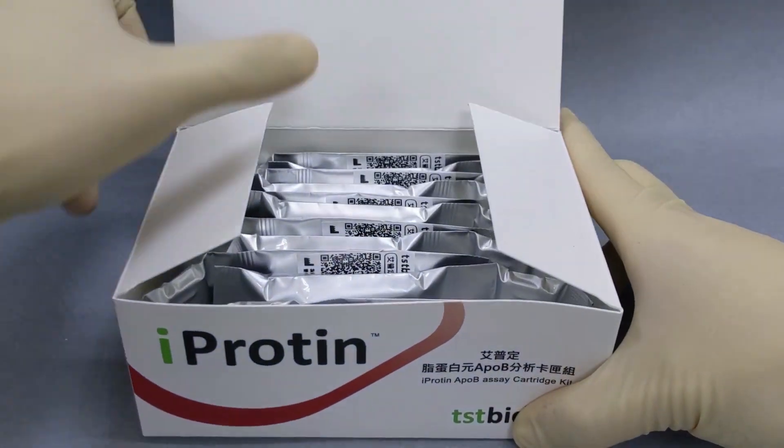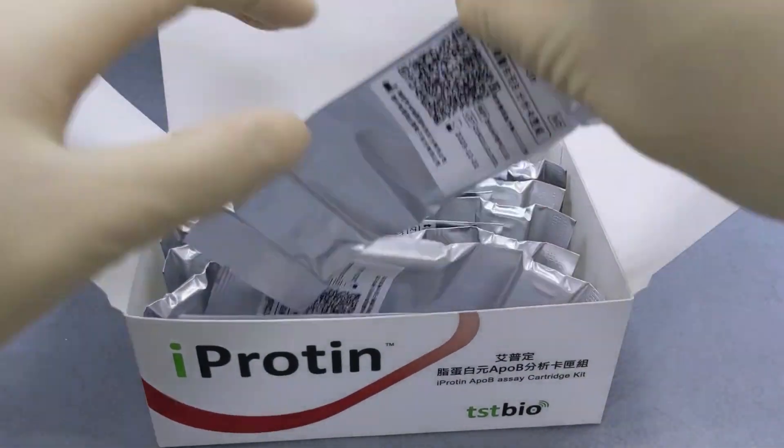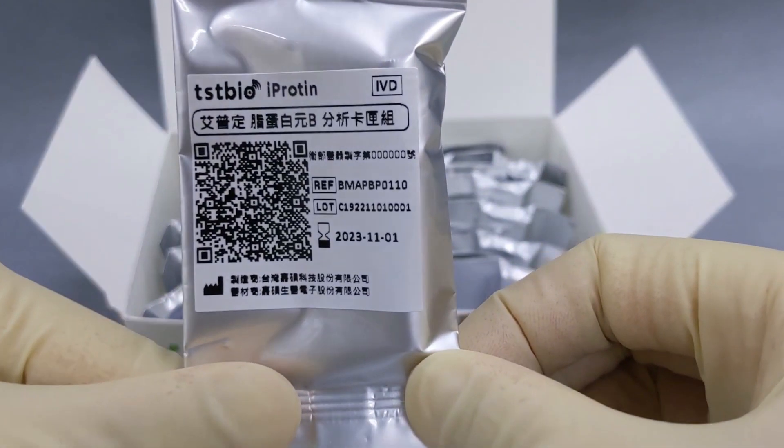Take out the assay cartridge kit from the box. Confirm the test item and expiration date on the label.